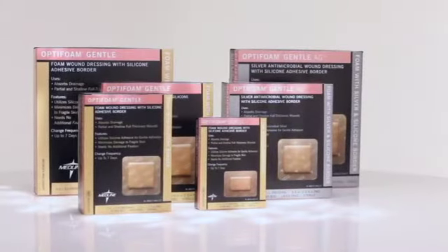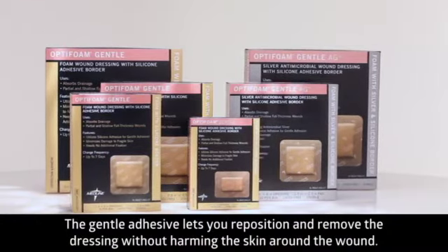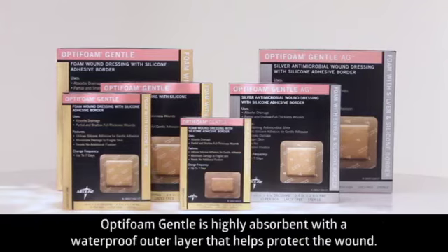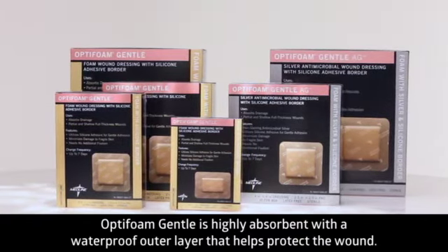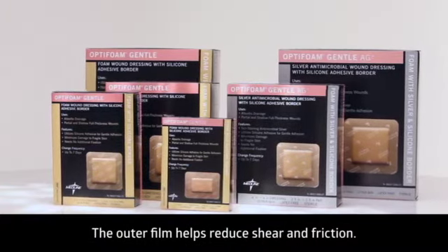Optifoam Gentle is a silicone bordered foam dressing featuring a gentle adhesive that lets you reposition and remove the dressing without harming the skin around the wound. It's a highly absorbent dressing with a waterproof outer layer that helps protect the wound. The outer film helps to significantly reduce shear and friction.